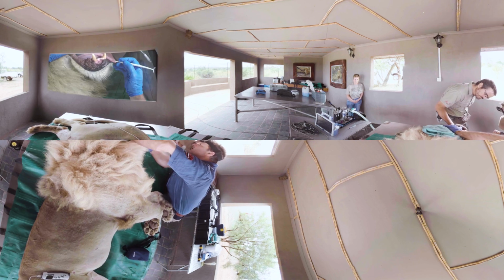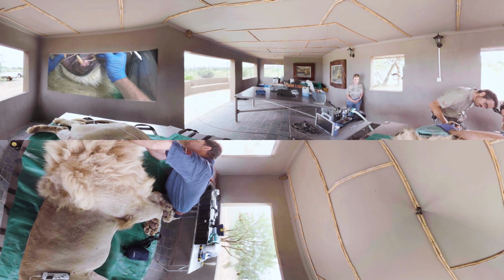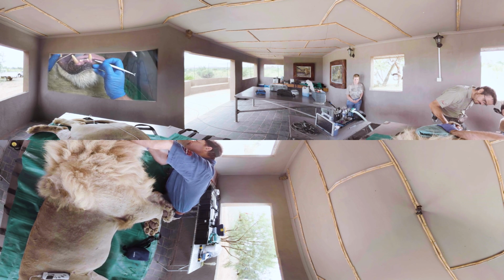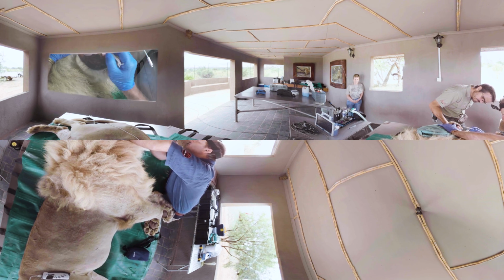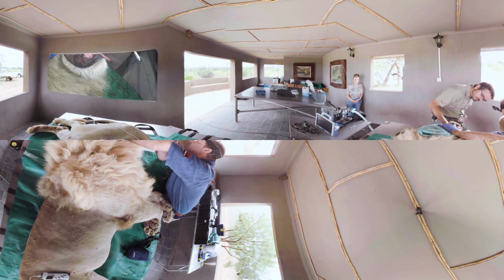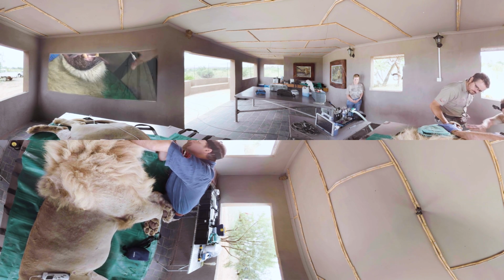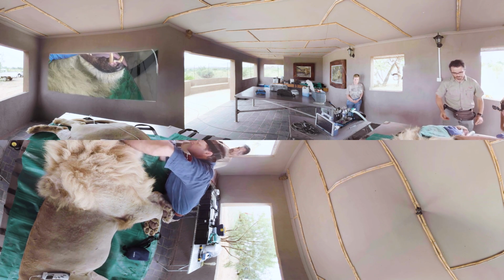We will just now turn him over, and then we can go and have a look where I did the surgery last time. That root canal as well as that root canal. So I think for now we're just quickly going to take an X-ray of this tooth, and once I'm happy with that, we'll turn him over. We'll have a look at the other side then as well. Okay, great. All right.